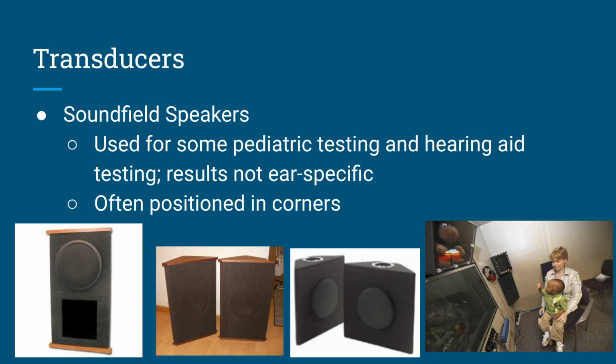So sound field speakers are used for some pediatric testing and for hearing aid testing. Results are not ear specific. That's the key thing to be aware of, especially in pediatric testing. Not ear specific. Even if you have them positioned in different corners of the room, often at 45-degree azimuth, it's not ear specific.